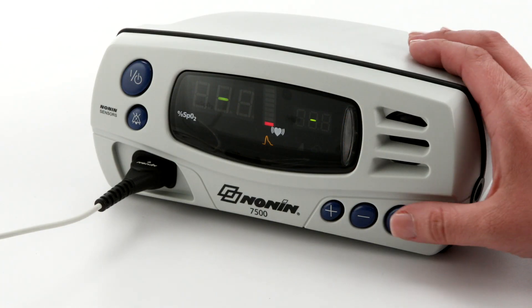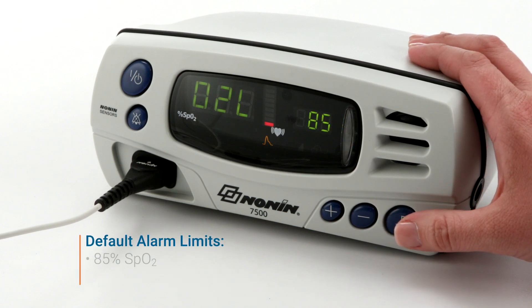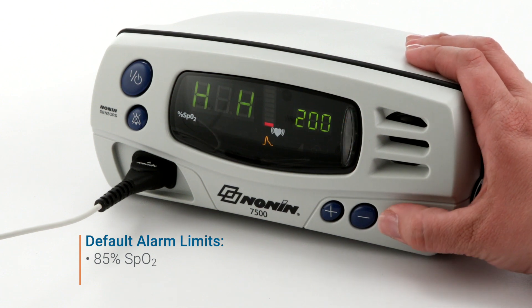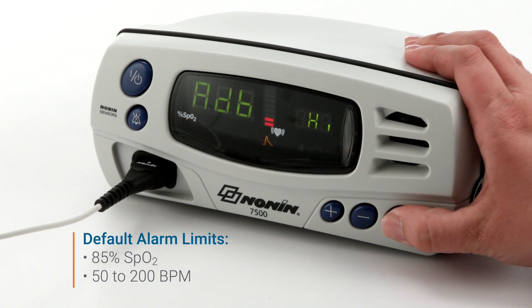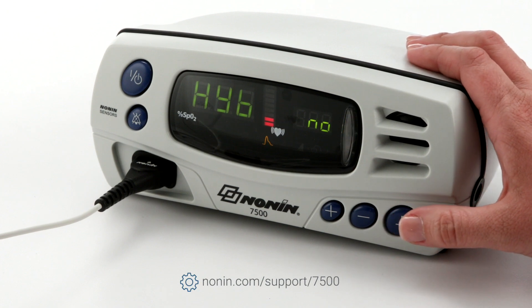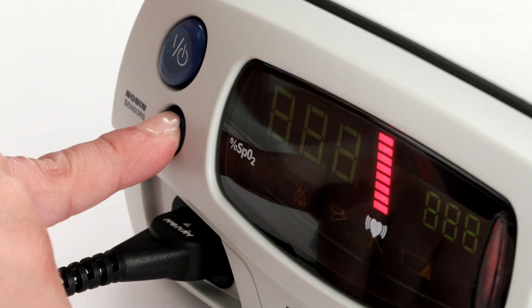It's recommended to set and check alarm limits and other oximeter settings prior to each patient use. The oximeter comes with a default low alarm setting of 85% SpO2, a low pulse rate of 50 beats per minute, and a high pulse rate of 200 beats per minute. These may be customized in the setup mode explained in the operator's manual. A patient security mode may be set to prevent changes to alarm limits and other functional settings.